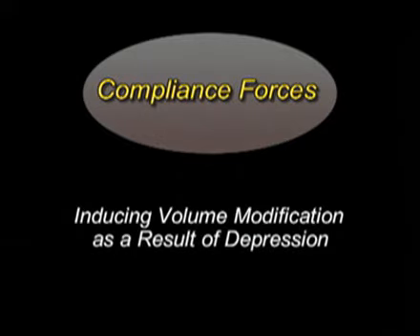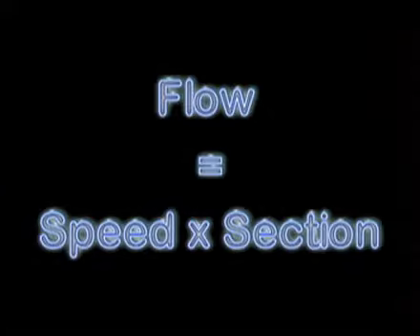The compliant forces are those that change volume under the effect of depression. For the most part, they are linked to the elasticity of the walls and to the appearance of air bubbles. The laws of physics remind us that the flow of fluid in a tube is equal to the displacement speed of this fluid by the internal surface of the tube.